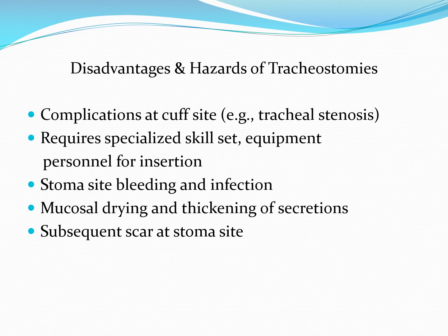So you can have much drier gas, particularly in the winter months, going into the airway, accounting for evaporation of the moisture in the mucosal wall and thickening of secretions. Subsequent scarring at the stoma site itself: once the patient is decannulated, they may have a depression or a scar there.